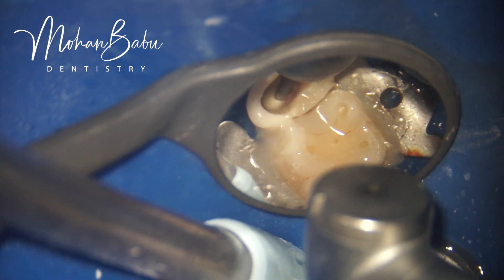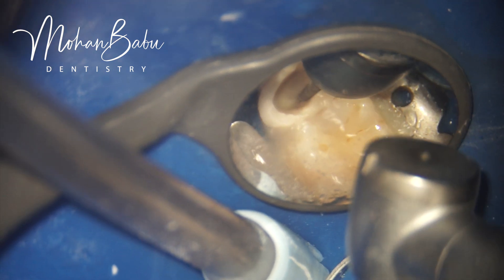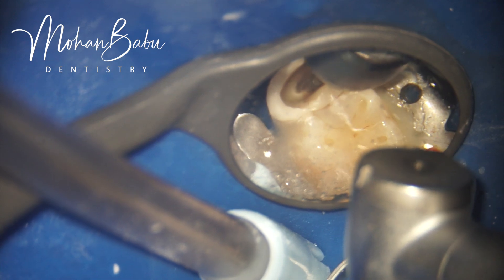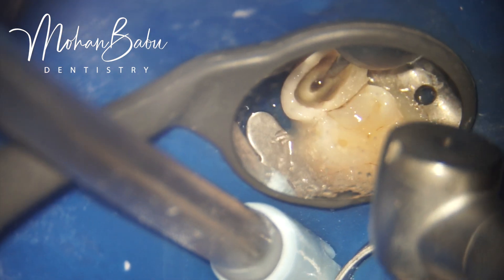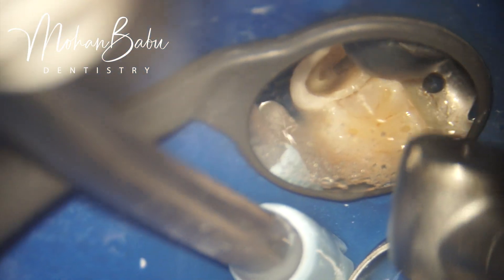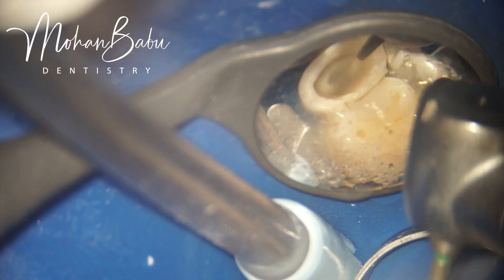In this particular case, the post and core is retained in the tooth solely by bonding. For bonding to succeed, isolation is far more important — it is absolutely crucial. In this case of extreme deep margins, we elevated the margin with proper isolation using the GIC matrix as a creative matrix technique, also called the stress-free deep margin elevation technique.